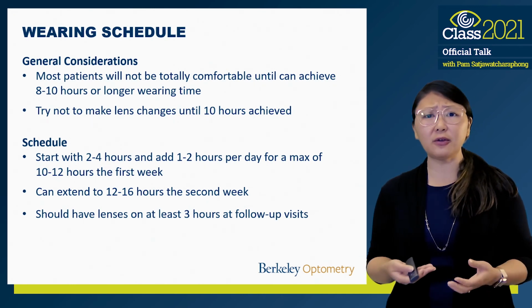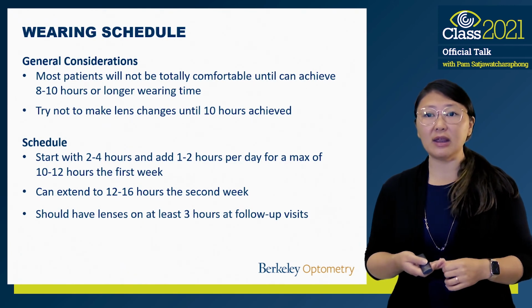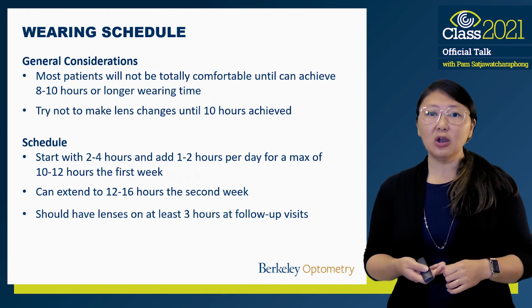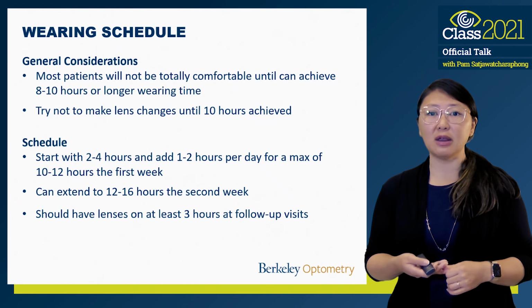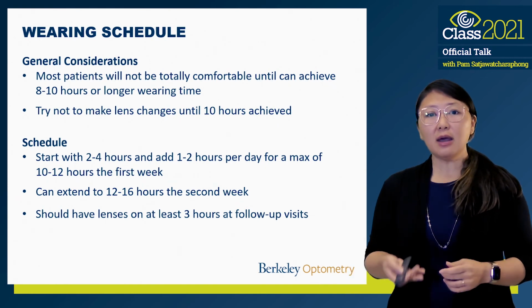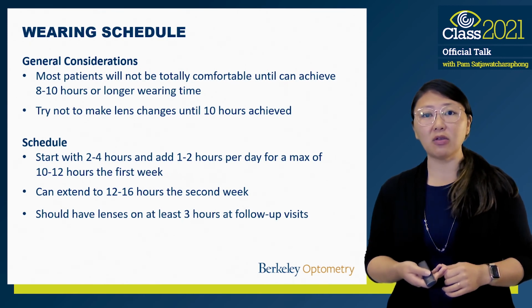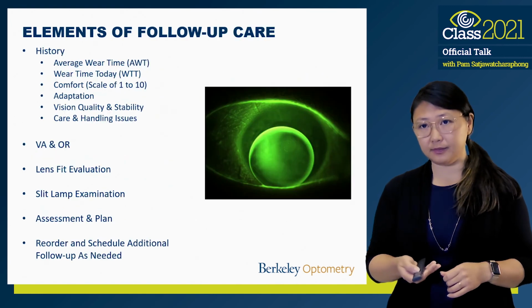You can extend this further up to 12 to maybe even 16 hours a day the second week if they've adapted, because a lot of our patients who wear these lenses really don't like the vision they have in their glasses or their soft lenses, and so they prefer to wear it for all their waking working hours. When they come in, you want to educate them to please wear their lenses at least a few hours prior to the follow-up visit so that lens is nice and settled when you evaluate it.